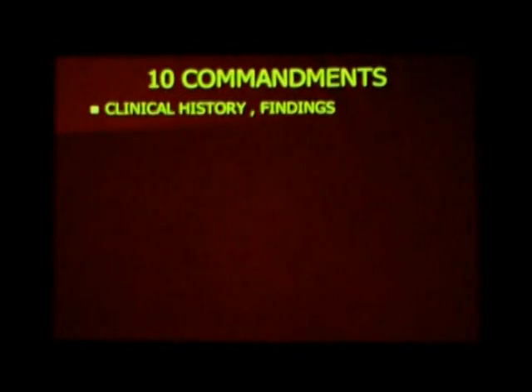So always in the ECG reading, you must look at the clinical history and findings. As I started saying, you must always have clinical data. The T wave inversion in a 20-year-old woman may be a different diagnosis versus a T wave inversion in a 60-year-old diabetic hypertensive gentleman. So this is the same T wave inversion, but it is the age of the patient and the risk of the disease that decides what diagnosis you are dealing with. So that's why it's very important.